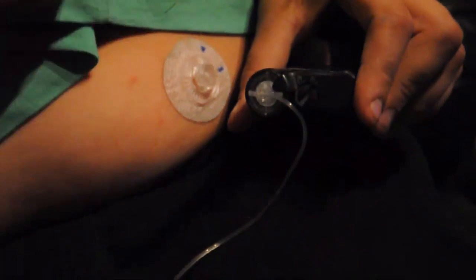And then I need to take the reservoir out of my pump. But to do that I've got to take this little clip off that I've got. So you just get the end of your reservoir inserter, insert it into the clip, twist, and then that slides off. You just twist that out like so and then press Act and then you're ready to go on to the next step, which now it's rewinding.